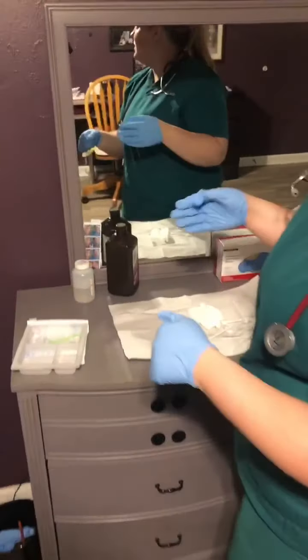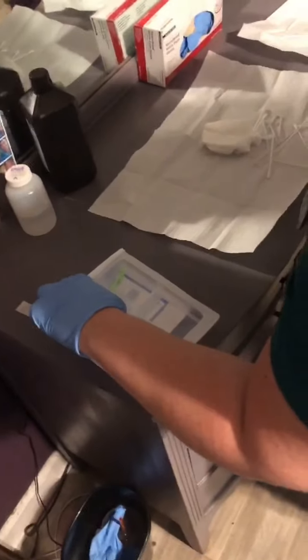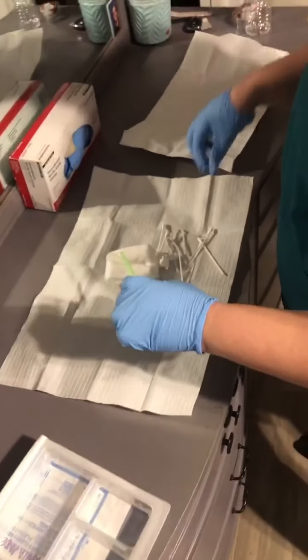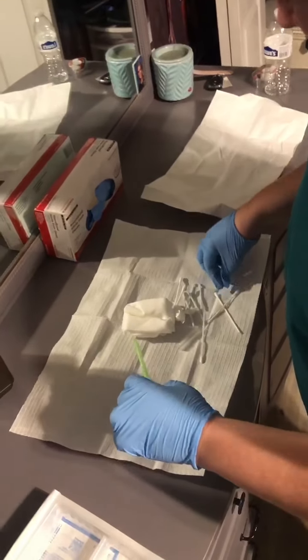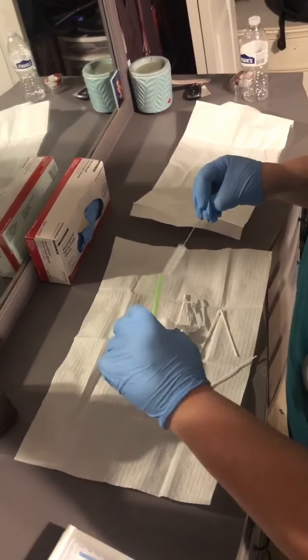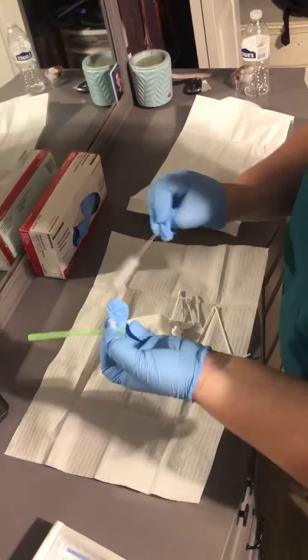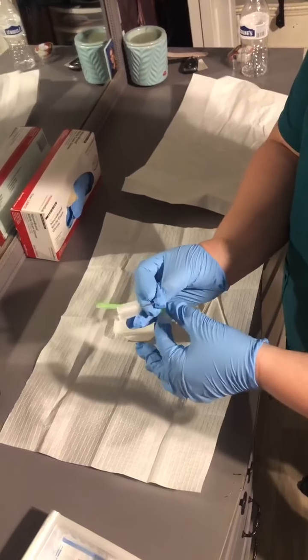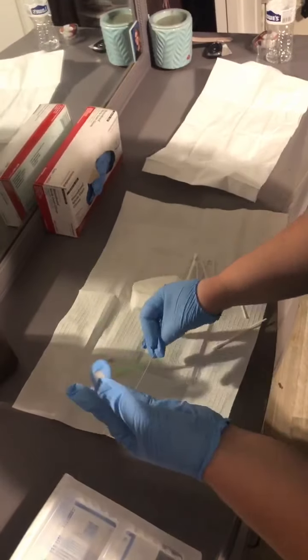Okay, so now I'm going to come over and clean the inner cannula. I'm going to make sure I'm only holding the outside, and I'm going to take my pipe cleaner. For purposes of the video I'm going to take this out, but pretend like it's still in there and it'll be thicker.